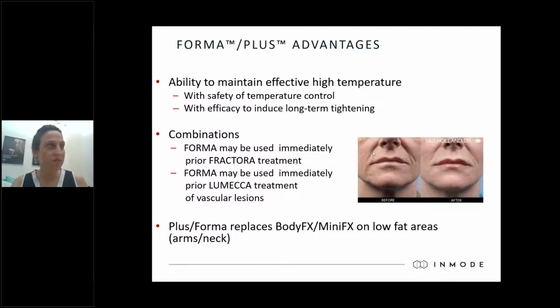We have a question from our friend Dr. Pandit from India. He's asking, what is your time of duration for full face and neck? Like 60 minutes, 70 minutes? I think it really depends. If you're discussing treatment time, it really depends on your patient age and needs and indication and size, treatment area size. Let's say the shortest possible way would be 10 minutes per zone. So 10, 10, 10, 10. That's already 40 minutes. Additional 20 minutes on the forehead, that's 60 minutes. And we have at least 4 zones here. That's another 40 minutes. So the minimum recommended time for Forma treatment, facial and neck treatment would be 1 hour and 40 minutes. That would be the minimum.